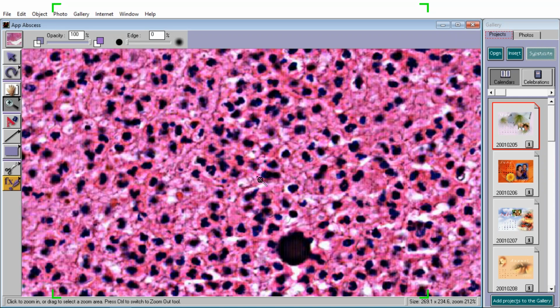neutrophils again. So what do you call it when you have a big localized collection of neutrophils anywhere in the body? You call it an abscess. So this is a periappendiceal abscess. So why would you have an abscess in acute appendicitis? Well, maybe the appendix ruptured, okay? And now you have contents outside of the actual appendiceal wall.